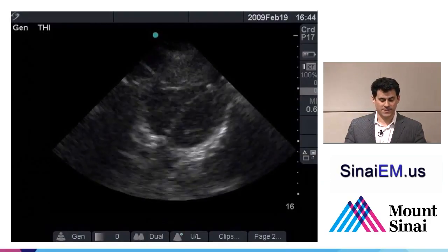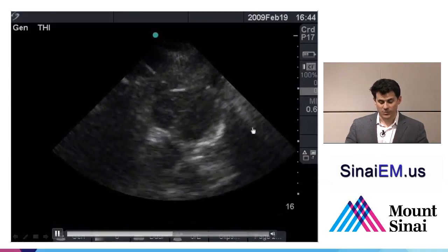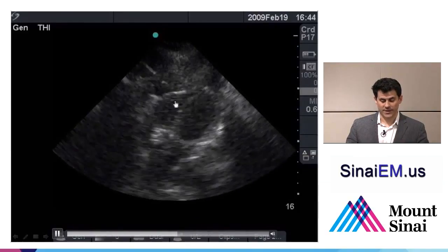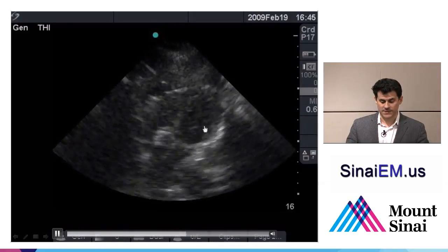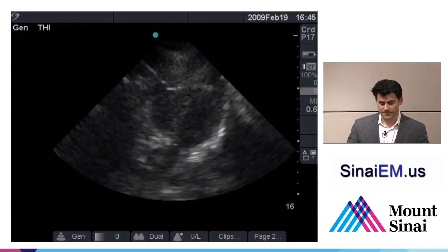Here's a similar concept in a healthy person who is severely dehydrated, a normal healthy heart beating with a hypercontractile contractility, and again, the chamber size is getting very small, a lot of blood being pumped out.